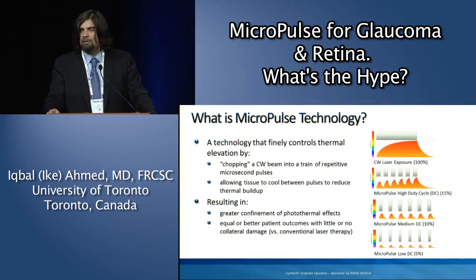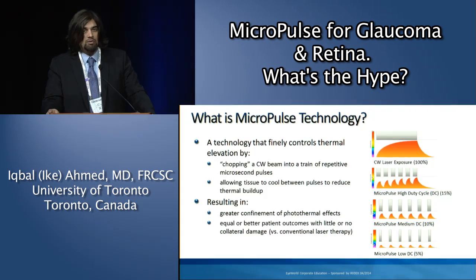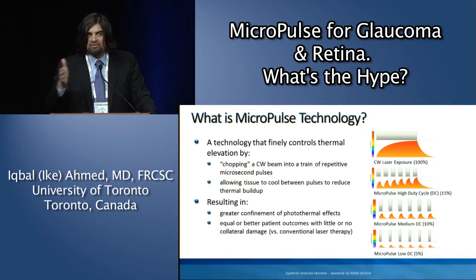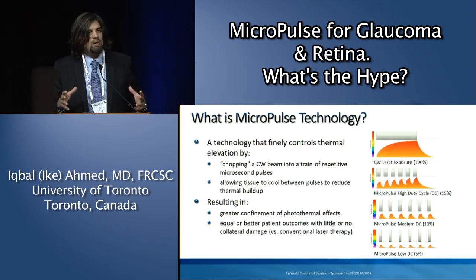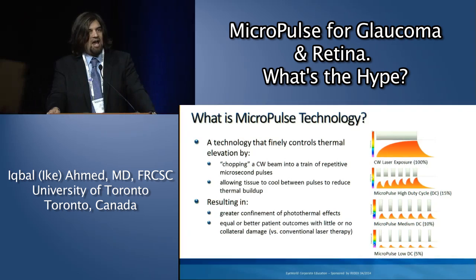And this is where MicroPulse, I think, is a really very innovative approach, and again, I think we've got to give credit more to the retina community first for really working in this area, allowing us to chop that laser energy into small, literally microsecond impulses here to reduce the exposure of that energy causing excessive heat, being within the thermal relaxation time of tissue to reduce the collateral damage that occurs with tissue. That is a concept we're introducing here. So it's a finely tuned machine.